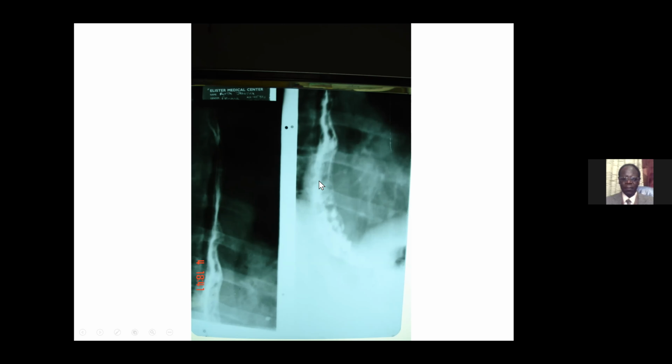in the circulation of the esophagus, which anastomoses with the spleen, the short gastric veins. Yeah, and this happens when there is portal hypertension and there is reversal of blood flow. Yeah, so indeed this was the case, and this is what they can rupture and cause hematemesis. Yeah. The commonest cause would be due to schistosomiasis. Yeah.